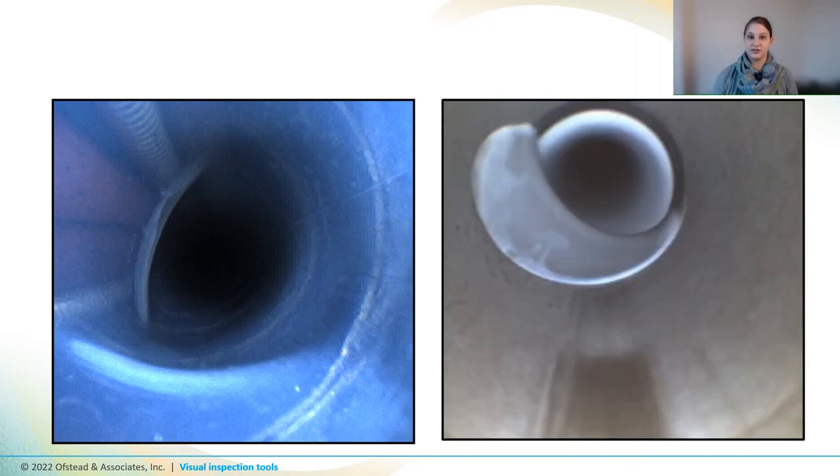If you encounter an obstacle in the channel, slow down and gently rotate the boroscope so you can get a better view. If you encounter a badly dented channel, debris, or thick fluid, stop and take a photo before gently backing out of the scope — this will protect both the boroscope and the endoscope. We recommend photographing any irregularities that might require action, though it's not necessary to photograph every single droplet or scratch. If there are a lot of issues, take one photo of each type of defect for discussion with your team about fixing the problem and reducing risk.